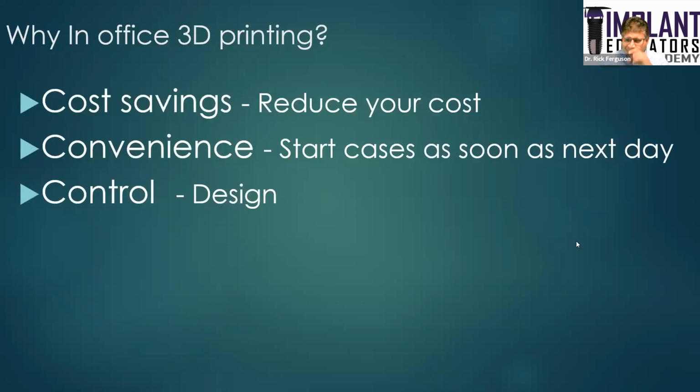As a matter of fact, I'm actually quite a procrastinator. So a lot of times for my surgical guides, I'm designing them the night before. And because I am teaching courses and so on, we get very busy, so things sort of fall through the cracks. So by having the ability to design things and print them very quickly, it gives us a lot of control. So here's an example of that control.